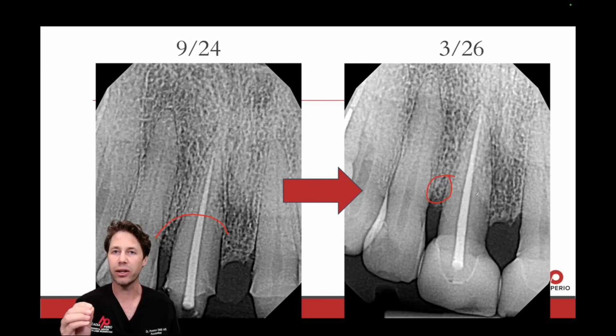first year post treatment. We know that we'll get an additional 15% of bone fill in year two, and an additional about 5% of bone fill in year three. So, again, with one laser treatment, I will continue to get improved density in bone fill for up to 3 years.